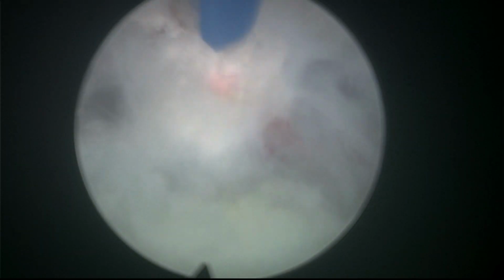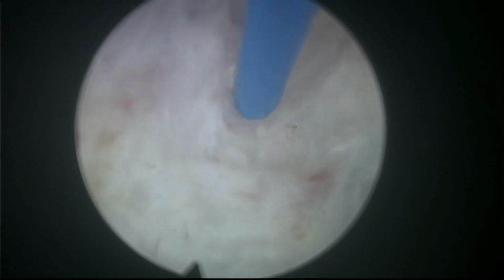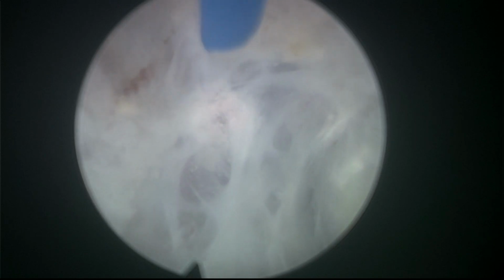Sometimes we have to dissect very, very deep nodules, and the capsule is very, very thin, and we can manage those with this approach. So here you can see how the fiber is still anteriorly. I go around the adenoma, but you see the energy. So my point is the angle of incidence that you can get by rotating the fiber continuously. The modification in the angle of incidence is not so relevant.